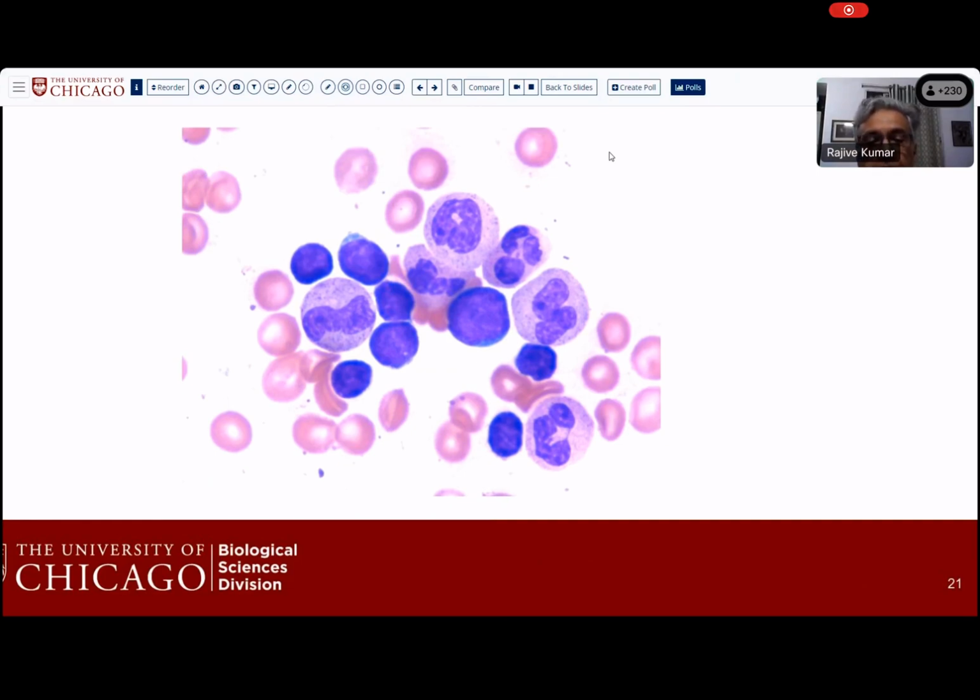Those who missed this point made by Dr. Sandeep should please note. I agree with you, sir. Sandeep, want to say something? No, I completely agree. Especially in patients less than 1 year old, you really have to be mindful, because for us the patients have ITP and they need a bone marrow before they can be started on steroids, and you end up with a field that looks like this. There are so many mature neutrophils here, so many lymphocytes here, this cannot be a malignant marrow. In this particular field you can see the progression, from the least mature cell here, and eventually from here to there to there. This is what I look at when I'm trying to morphologically decide what these are.